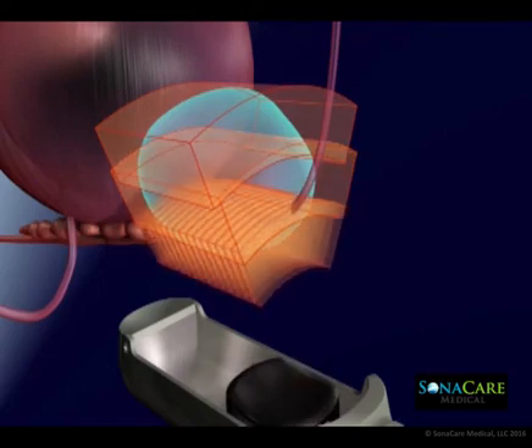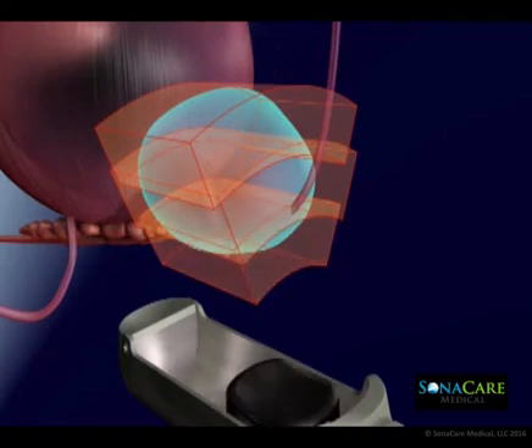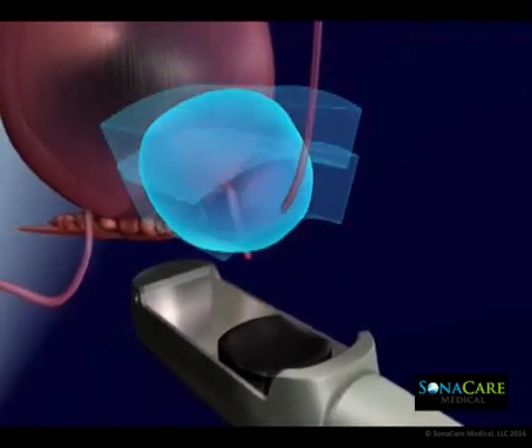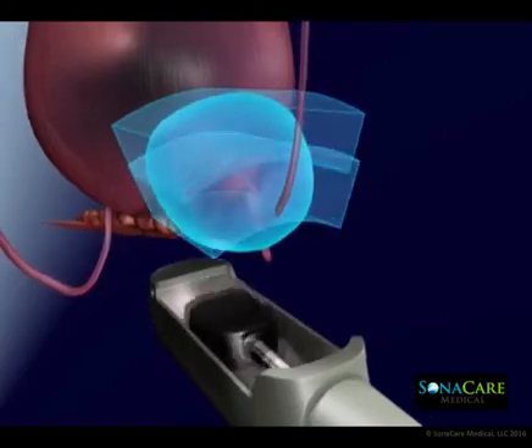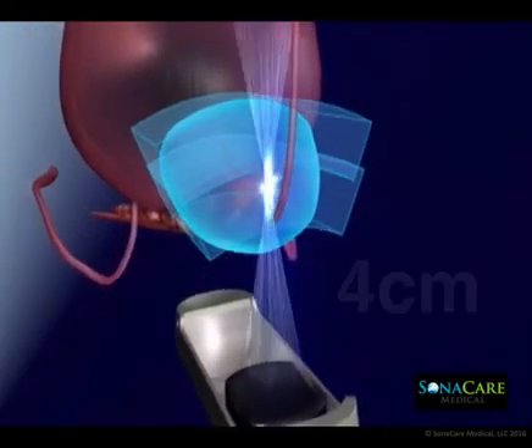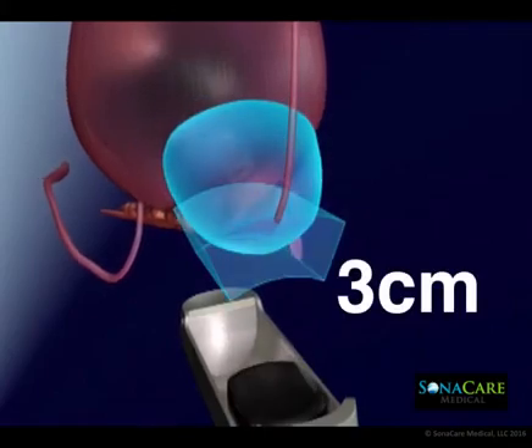Sonoblate features a two-sided transducer allowing customizable applications with focal distances at either four centimeters or three centimeters. Precise focusing of ultrasound energy during a HIFU procedure rapidly elevates the temperature of the tissue in the focal zone.